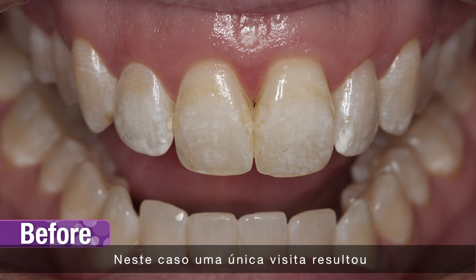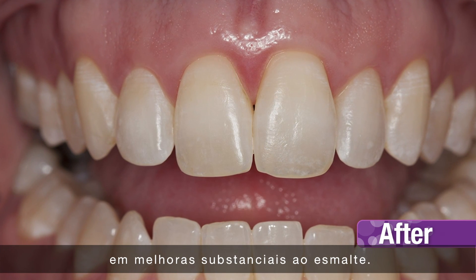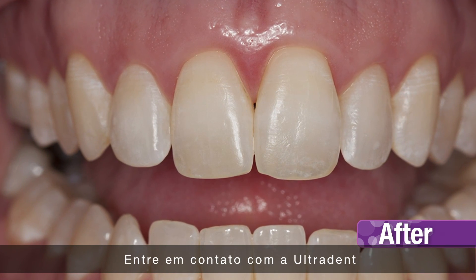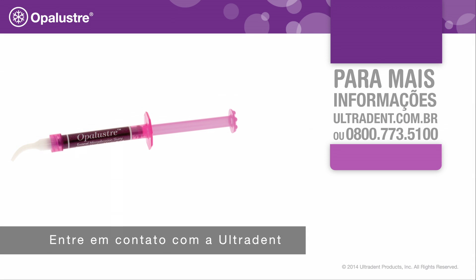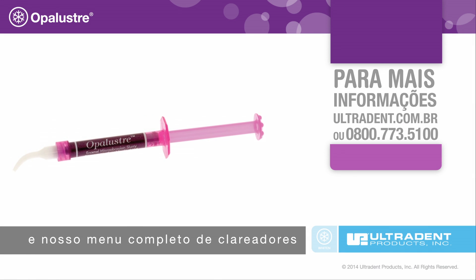In this case, a single office visit resulted in significant improvements to the enamel. Contact your Ultradent representative for more information on Opal Luster and our entire menu of whitening treatments.